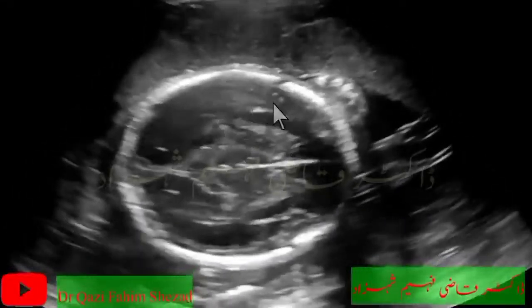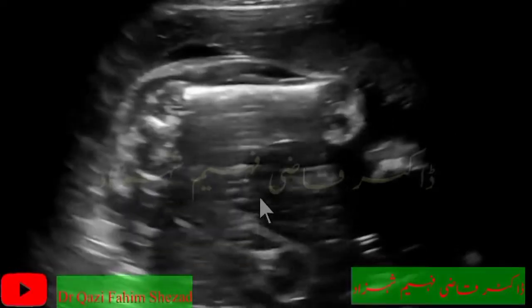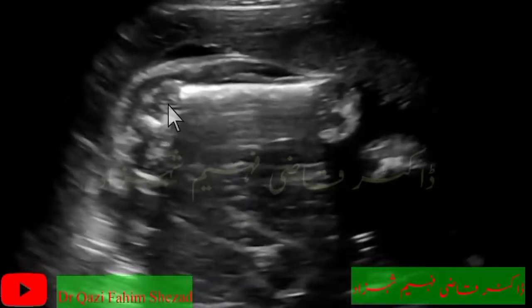Here you can see the head of the fetus, and here you can see the heartbeat of the fetus. This is an active fetus, and I'm going to show you the genitalia of this fetus. You can see the parts of the fetus.